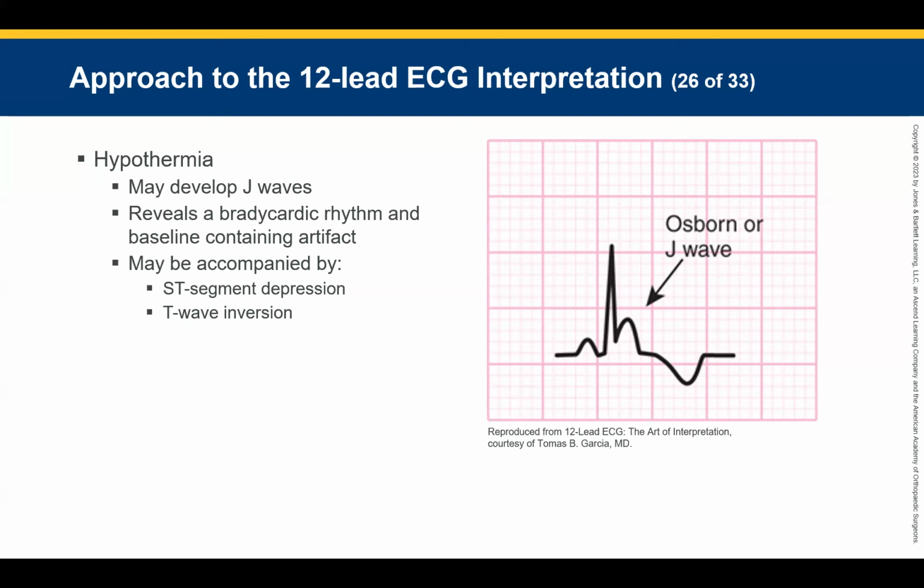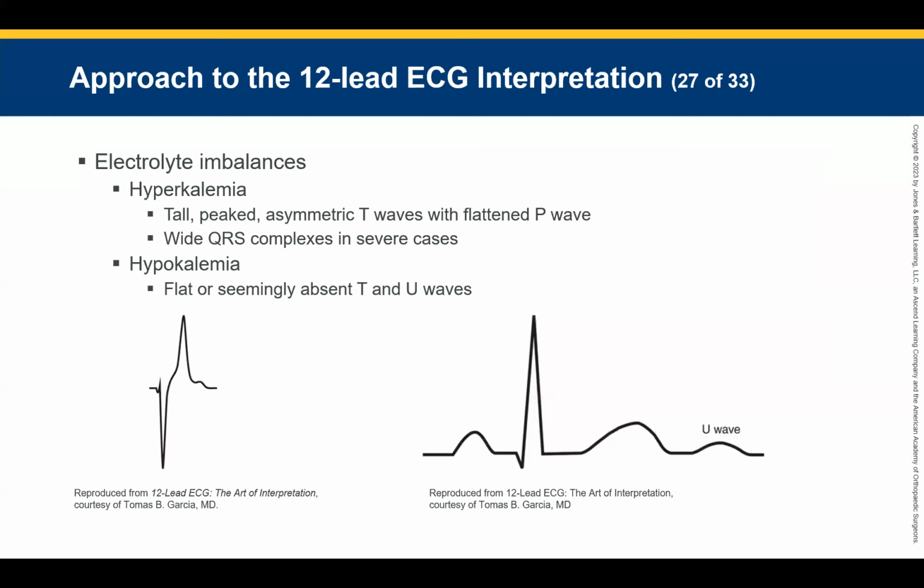Don't trip on that being an Osborn or J wave. Just know that that extra little beat goes along with hypothermia, being too cold.